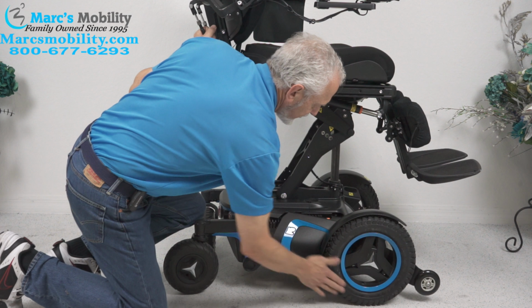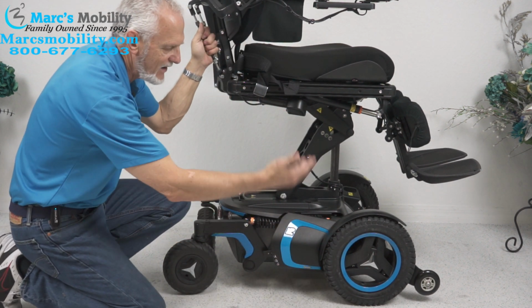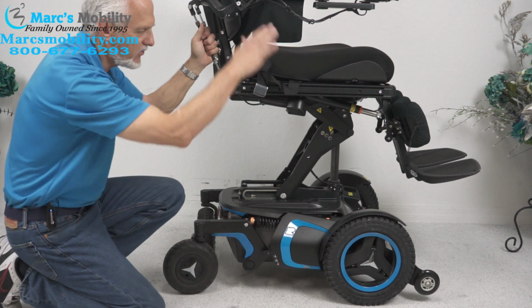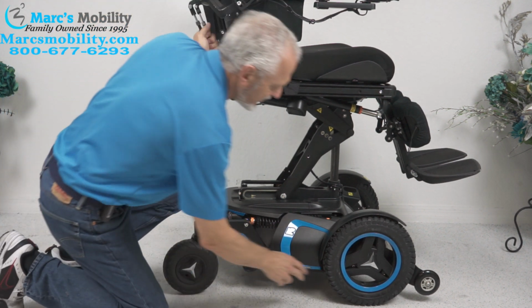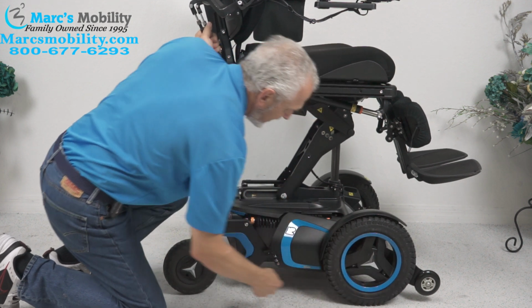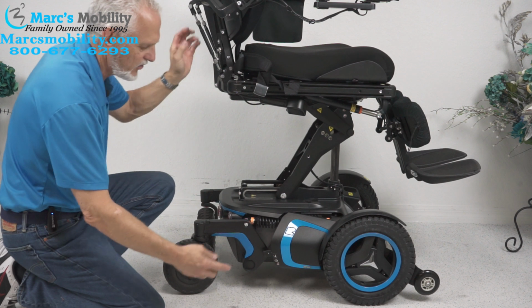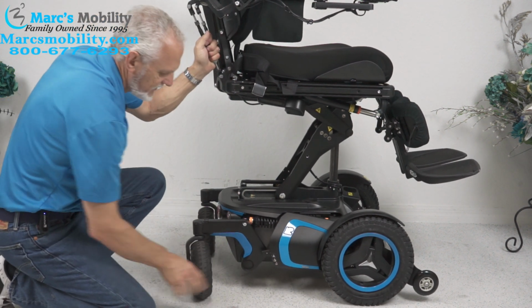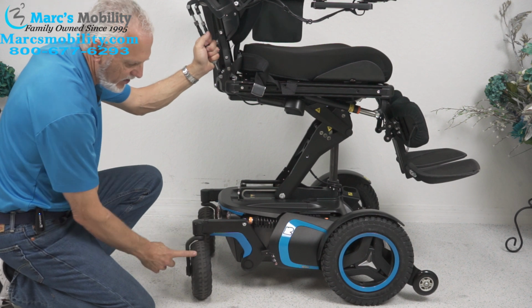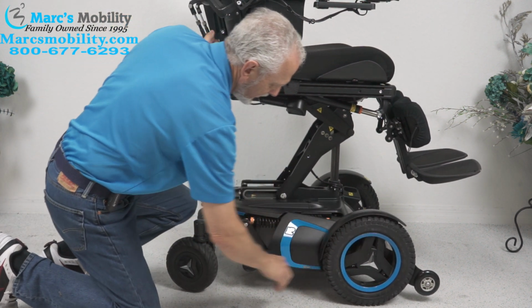All right, so we've covered, these are 14-inch. This is a front wheel drive chair, so it's good for inside, but it's also really good for outside, because all the weight of the chair, 400 and some pounds, plus the weight of the user, let's say 200 pounds, that's 600 pounds. It's going to be transferred right there. So if you're outside in the grass or outside, it gives you better traction. Plus, you have the aggressive tires on this chair. Aggressive tires mean you have sharper ridges on it, and you can see on this one how the knobs are pretty big.